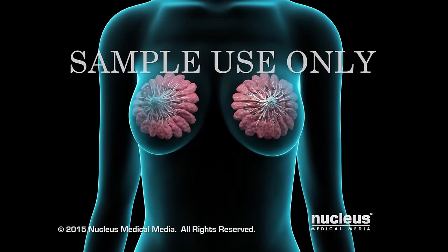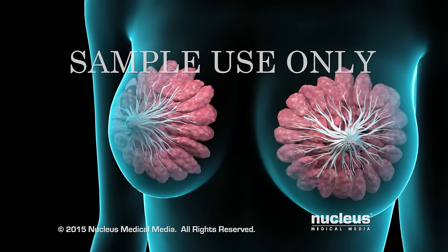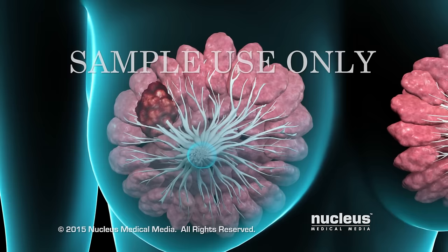A breast biopsy usually is performed to determine if an abnormal area or lump in your breast is cancerous. In this procedure, a tissue sample of the area of concern is removed so it can be examined by a pathologist.